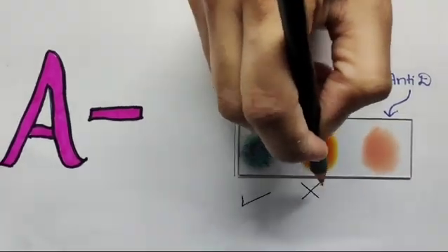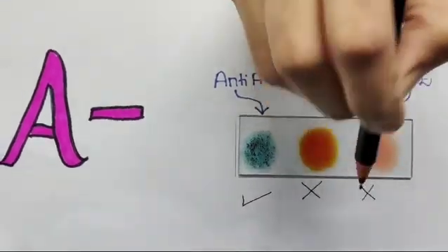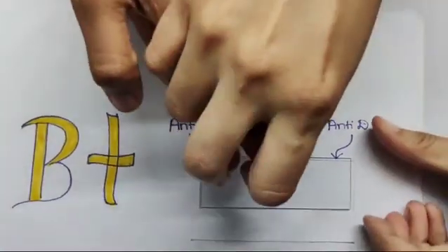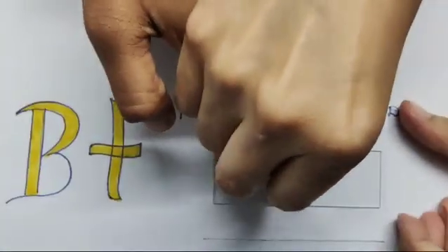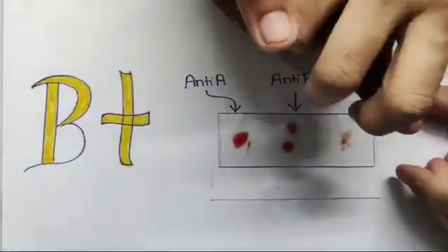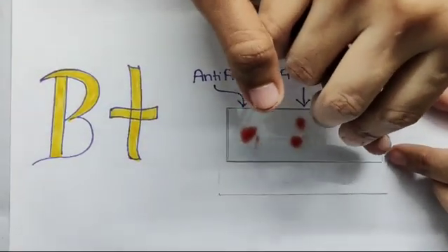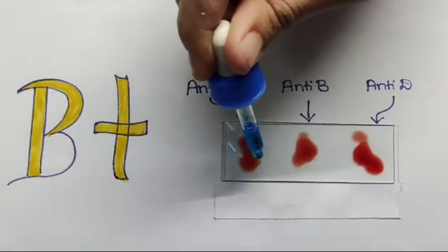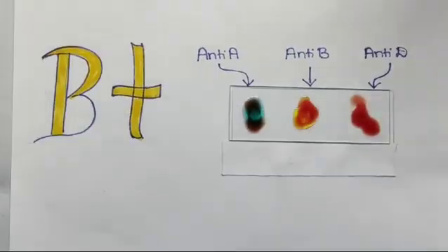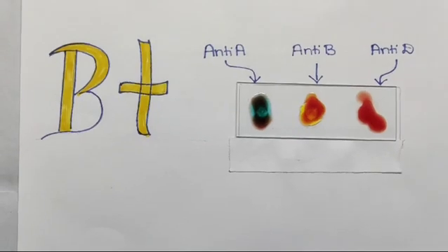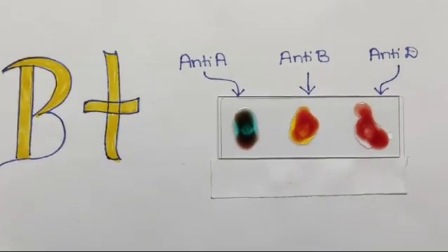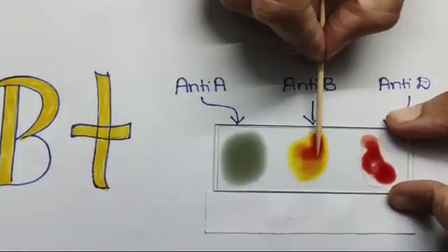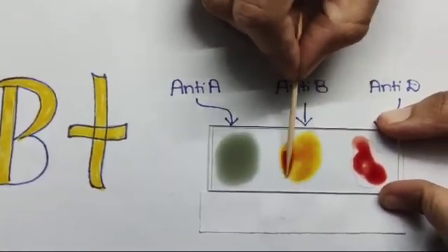For determining B positive blood group, repeat the same procedure and observe. Clotting is only seen in anti-B and not in anti-A, which means antigen B is only present. It is B blood group.